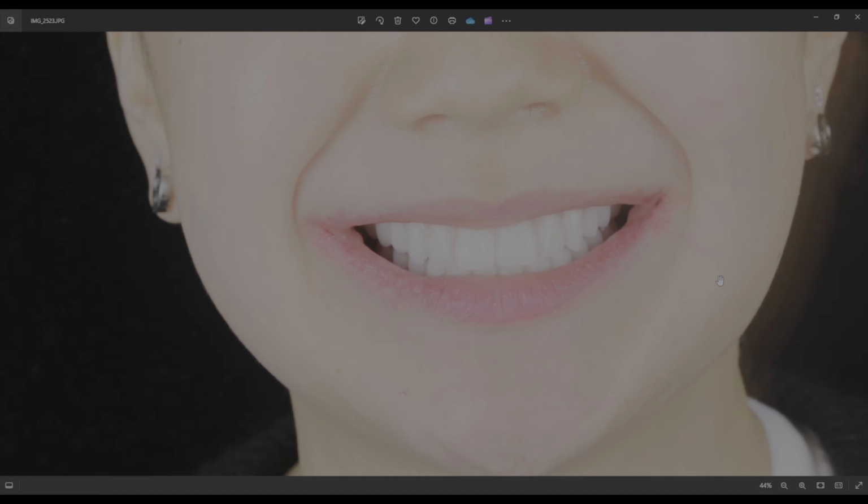Okay, yeah, so this case actually stressed me out, right? Dr. Koukousaki, you restored the case and you did a great job, but Dr. Koo, you were also with me in the surgery, right? Remember when I was placing that trans-sinus implant on the left side and you could hear that fracture? But we still got enough stability and we augmented the bone like crazy. We also did a little guided bone regeneration. A lot of times patients ask, hey, you never have to do bone grafting? We still have to do bone grafting in cases where we need to add bone to make sure the patient has the best long-term support.